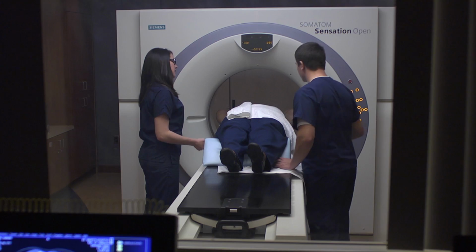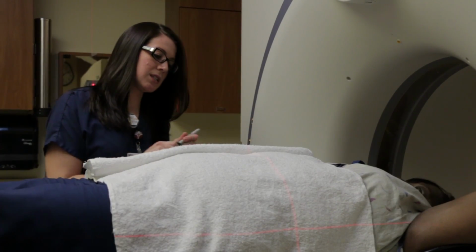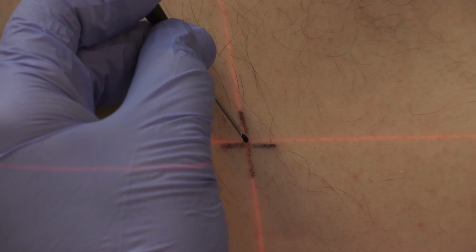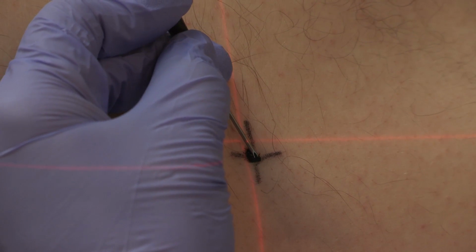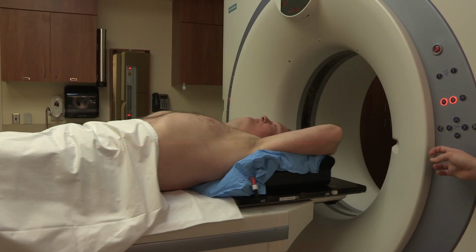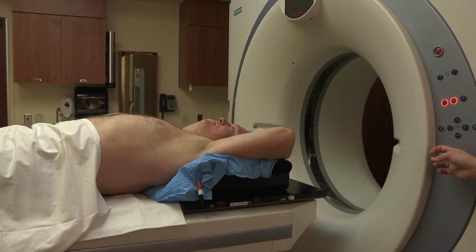We will place a couple marks on the patient's skin using just a marker. Once we have decided that those marks are in a good place for the doctor to plan his treatment, we'll actually give little tattoos in the place that we've drawn those marks on the patient's skin. The tattoos are permanent, but it is really small, like a little tiny freckle, and usually most patients don't even notice them or can't find them. The tattoo allows us to deliver the radiation very accurately with each treatment.